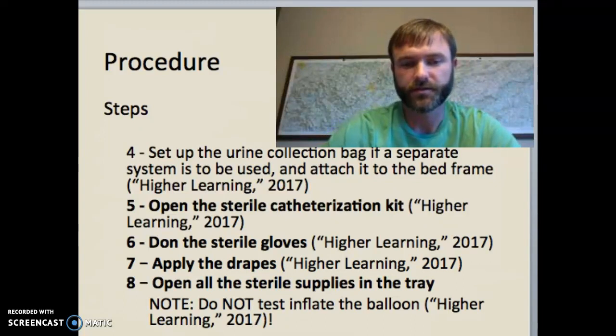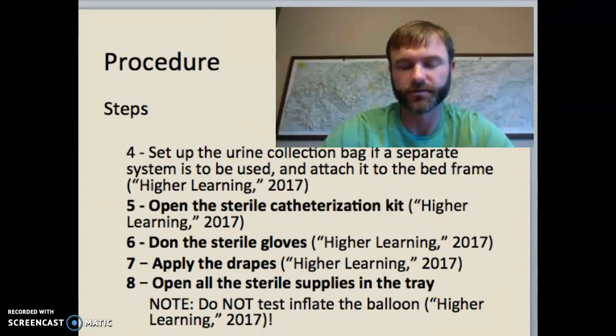Note, testing the balloon prior to insertion is not recommended. All catheters are tested during the manufacturing process. Also, inflation creates stress on the balloon that creates ridges and increases the surface area, which causes higher incidences of urinary tract infections and more irritation upon insertion.